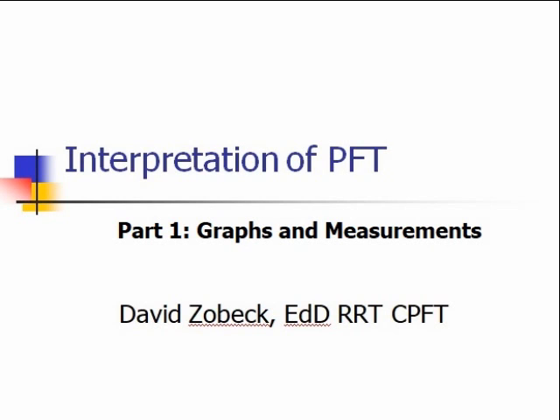I am going to cover some information that will help you in the interpretation of pulmonary function tests. In the first part, we're going to cover the graphs and measurements that are in a pulmonary function report. That is going to help you better understand how to interpret these complicated tests.